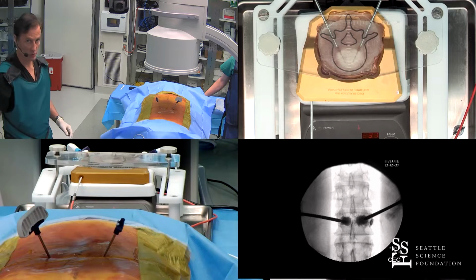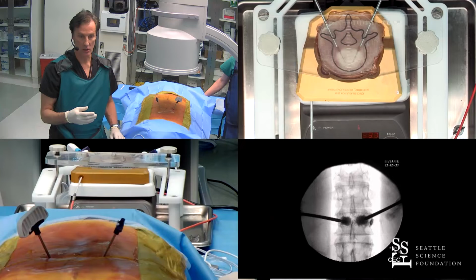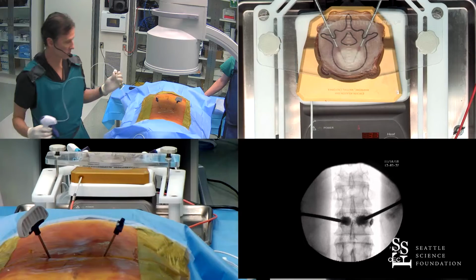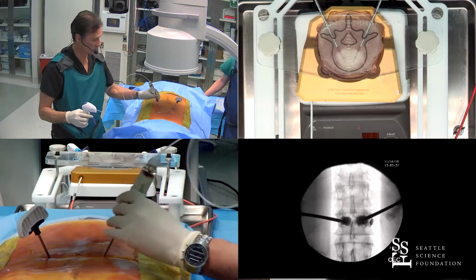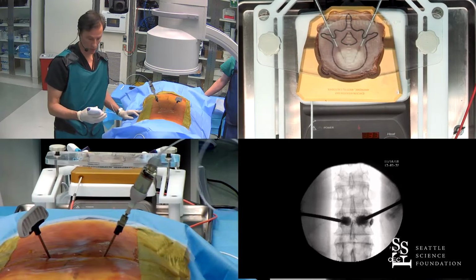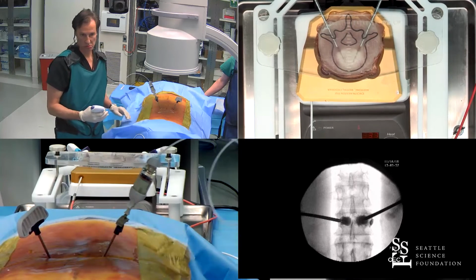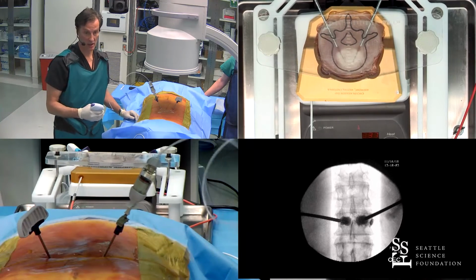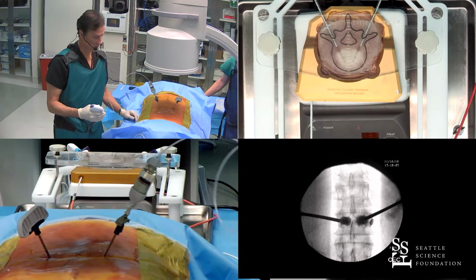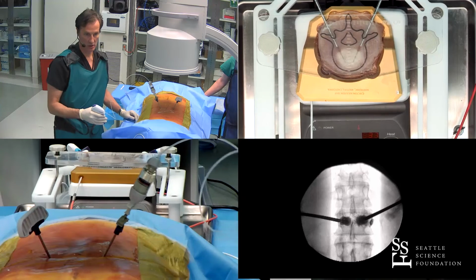So the only time you really have to worry about it is when the cement extravasates posteriorly or into the neural foramina. So cement extravasation is very common. The EVOLVE trial, 354 patients, extravasation rate of between 21 and 22%. But there's also reports of cement extravasation rates in vertebroplasty up to 63%, even more. And it's quite common. You just don't want extravasation in the wrong spots. The error I think people make is not putting enough cement.